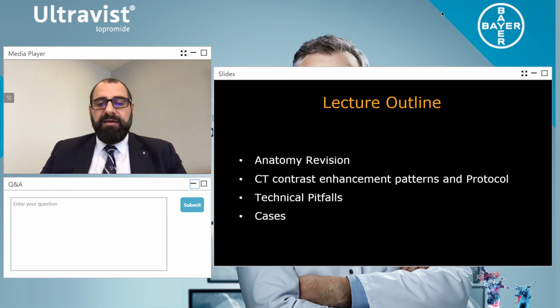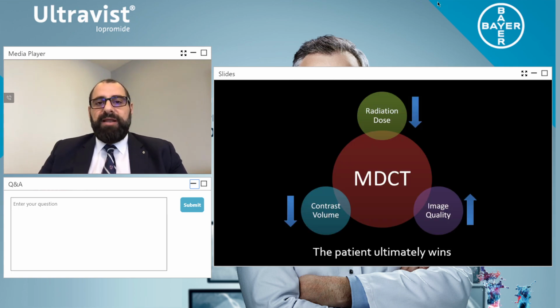If we look at why we are imaging, what is our philosophy, what is our drive, we consider these three components: reducing radiation dose, reducing contrast volume, and increasing image quality. If we put those three parameters at the center of our universe when we're designing imaging protocols, then we are able to accurately, effectively, every single time, give consistent image quality to radiologists for their reporting.